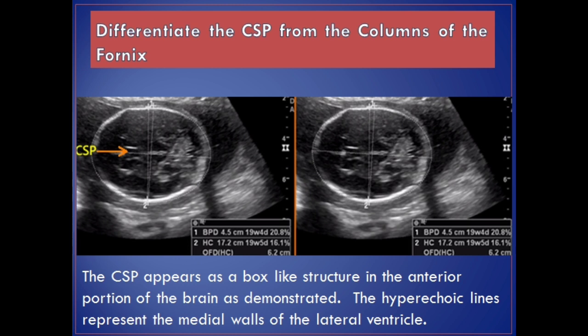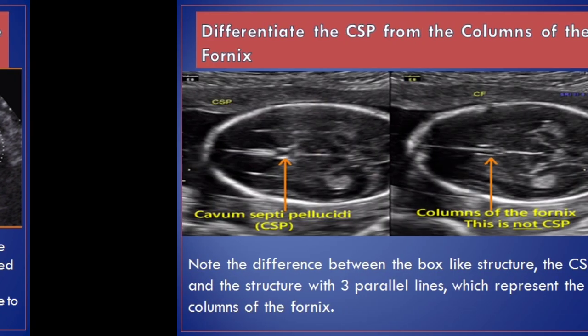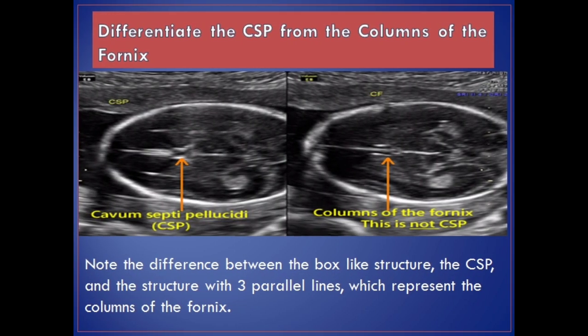The CSP appears as a box-like structure in the anterior portion of the brain. The hyperechoic lines represent the medial walls of the lateral ventricle. The three-line structure is not the CSP and represents the columns of the fornix. The fornix represents paired nerve columns, which are located just inferior to the CSP. The transaxial view when the fornix is seen suggests that the transducer plane is just inferior to the proper plane to obtain the CSP. Note the difference between the box-like structure, the CSP, and the structure with three parallel lines, which represent the columns of the fornix.